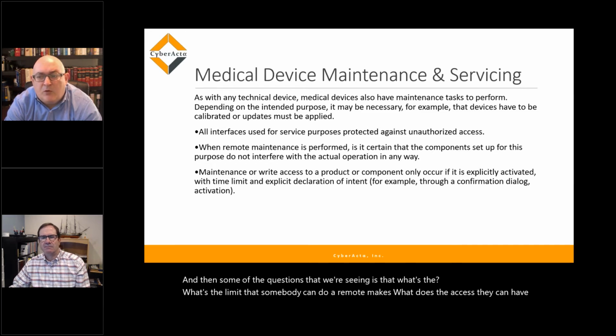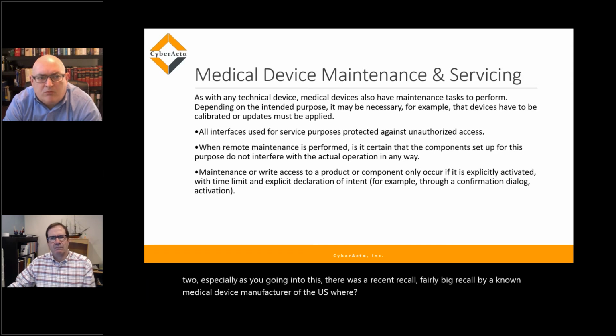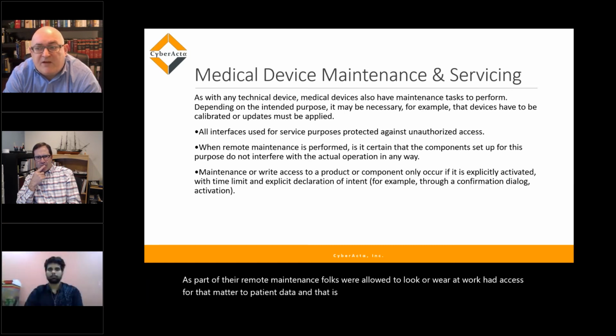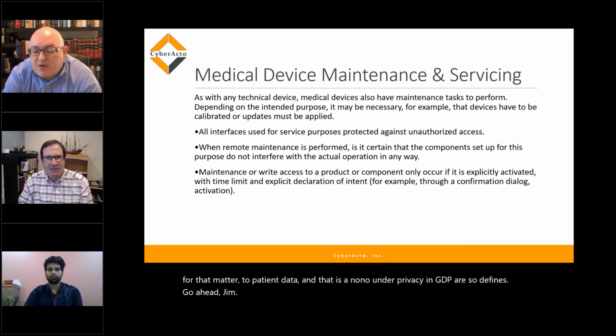There was a recent, fairly big recall by a well-known medical device manufacturer in the U.S., where as part of their remote maintenance, folks were allowed to look at, or had access to, patient data, and that is a no-no under privacy rules and GDPR. So the fines... Go ahead, Jim. Finish your sentence, John. I just want to jump in with another point.